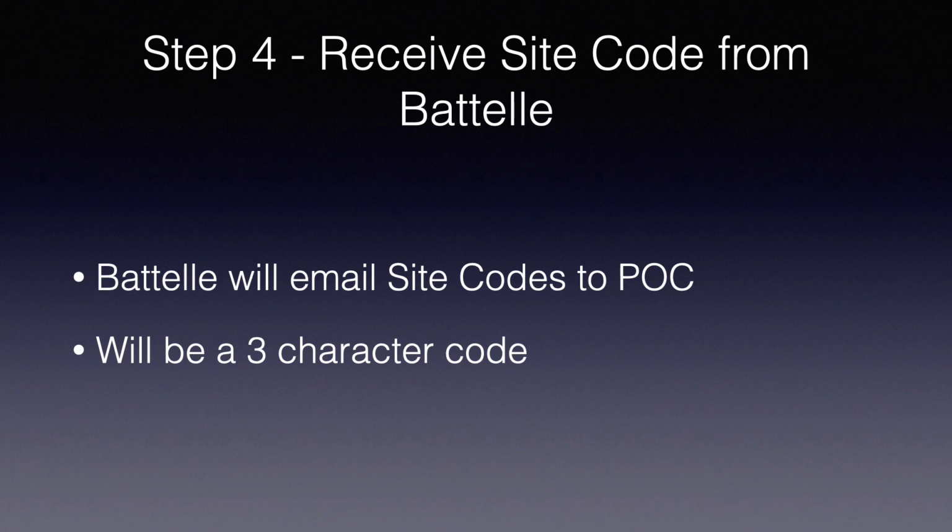The fourth step will be to receive your site codes from Battelle. This will take approximately 48 hours after you submit your form and before you receive the site codes. Please note that the site codes are generally 3 characters and so far have all been 3 letters.